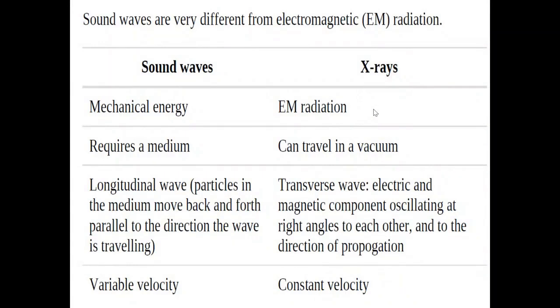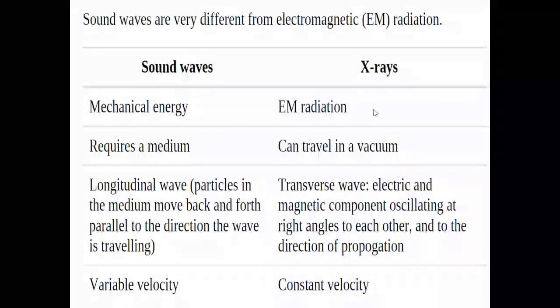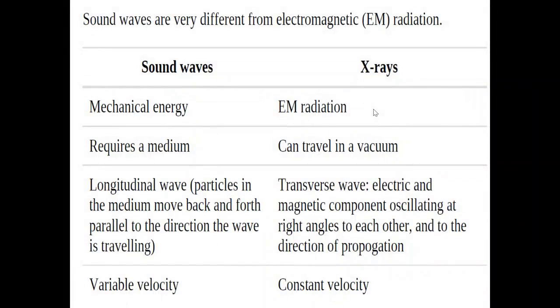non-ionizing, but there are some misconceptions about that. It is a type of mechanical energy, meaning that for it to propagate, a medium must be present for the sound waves to move through, unlike X-rays, which do not require a medium.